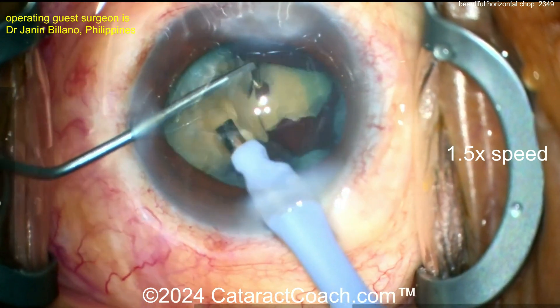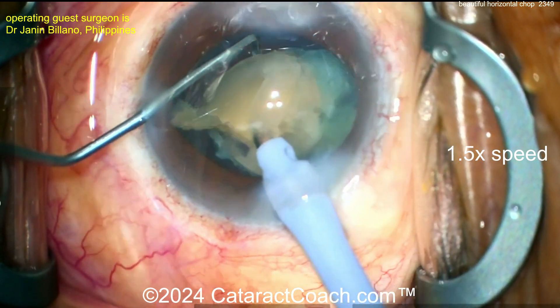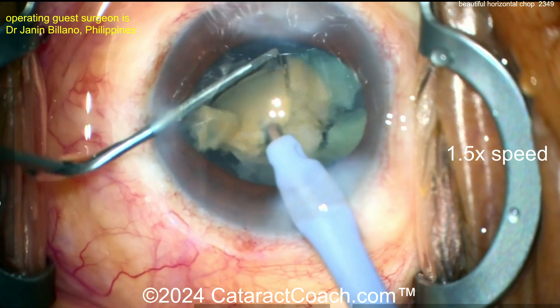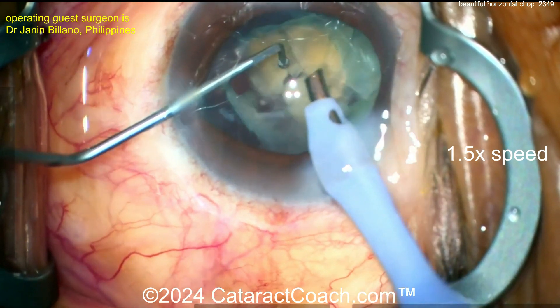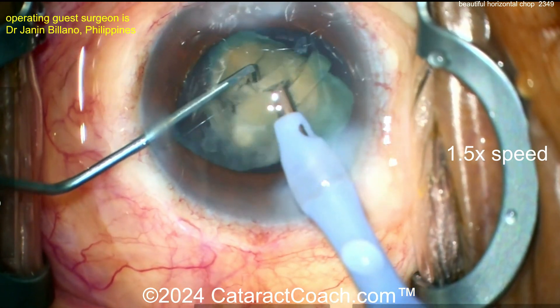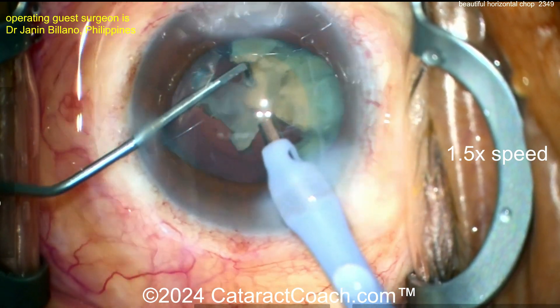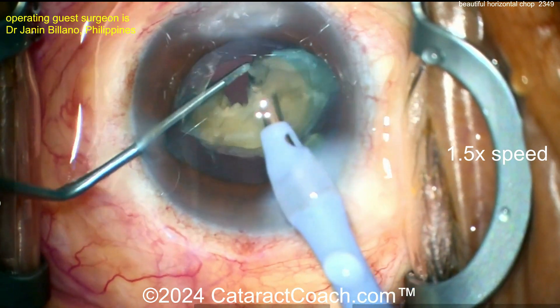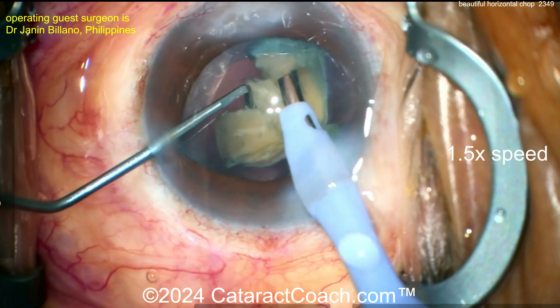Very nicely done. Now let's take out the last piece. As the last few pieces of nuclear material come up — another little chop, very nice — as the last few pieces come into your probe, if there's nothing weighing down the capsular bag, put the soft back side of the chopper towards the posterior capsule to protect it. Taking out these pieces here — nicely done, nicely done. Take this one out too — nice and easy.